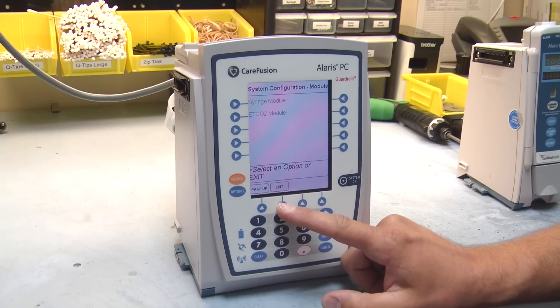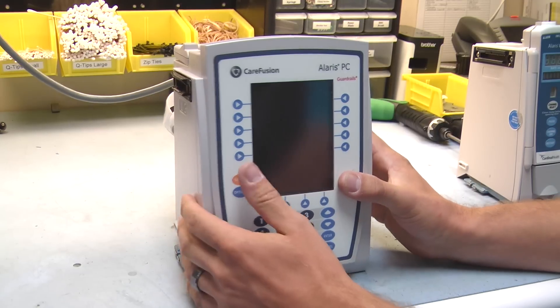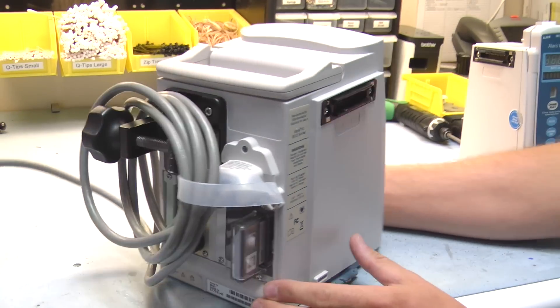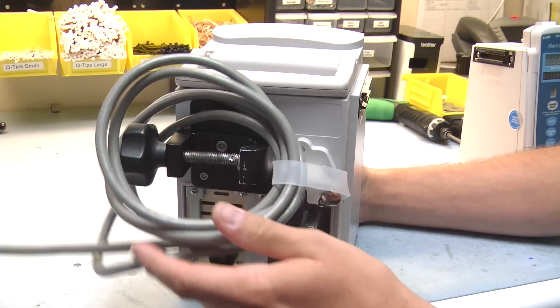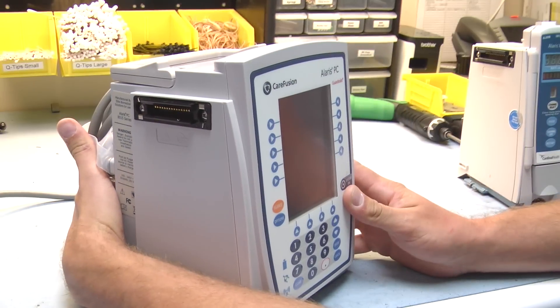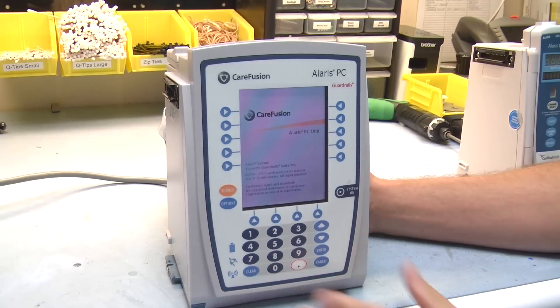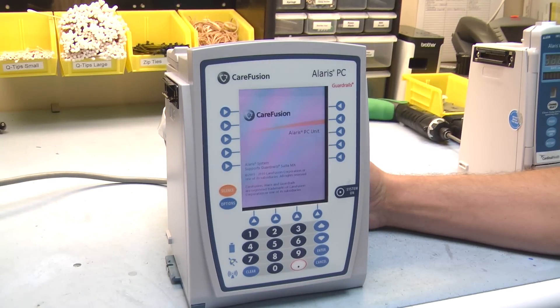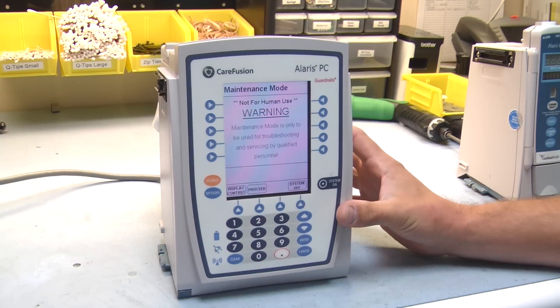We'll go ahead and exit out of here. The next menu I want to show you is the maintenance menu. To get into the maintenance menu, you're going to hold down your tamper switch and power on the unit at the same time. This is going to put you into maintenance mode.